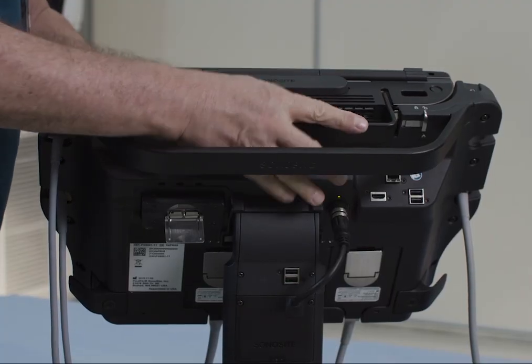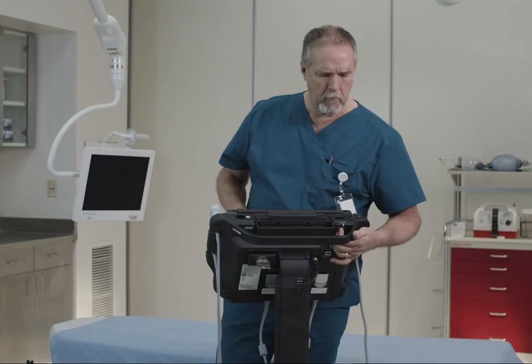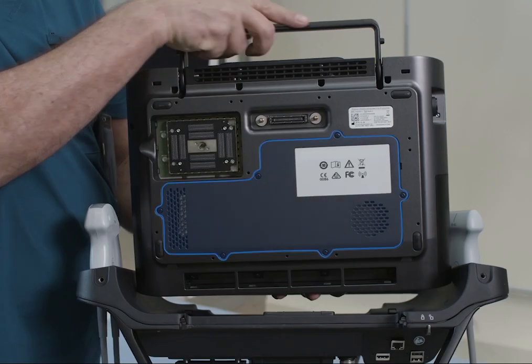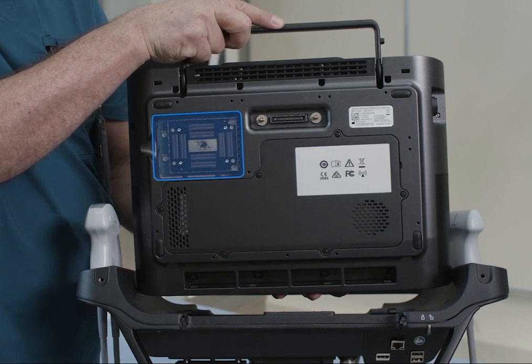For security, lock the Sonosight PX to the stand by screwing down the security latches. Or, leave it unlocked so you can easily move it. Off the stand, the Sonosight PX runs on battery power and can use one transducer at a time.